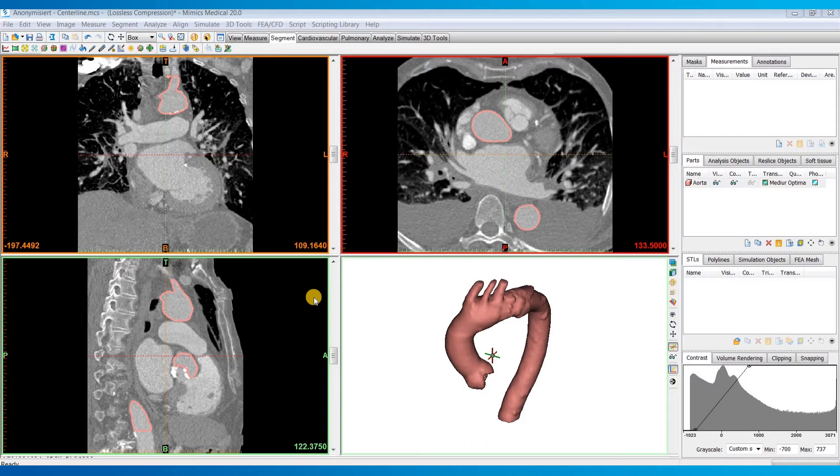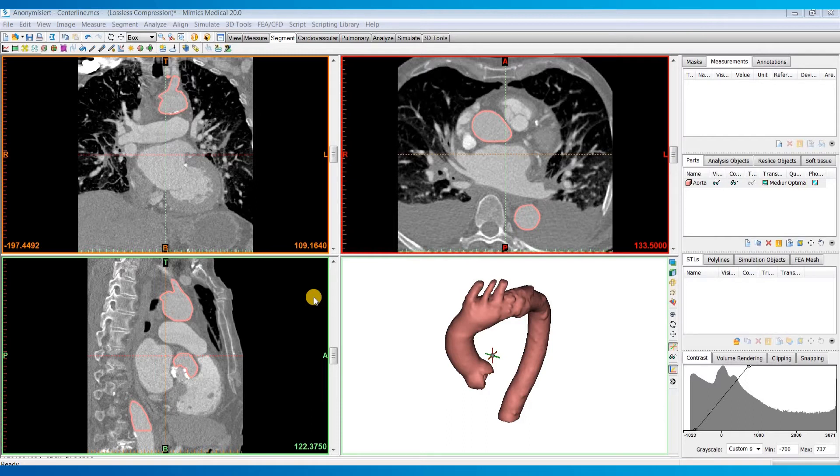If you had a hollowed model depicting the vessel walls of the aorta, then the software is going to try to calculate the centerline inside of the walls instead of the vessel, and that's not what we want. So it's important to have a solid part from which to calculate the centerline.